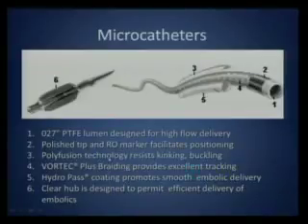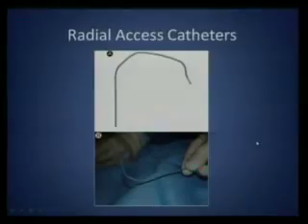It has polyfusion technology to resist kinking and buckling, so the whole catheter has this. These catheters are braided for support and tracking. Hydropass means they have a coating on the inside so that the embolic material goes very smoothly and easily. And they have a hub here through which you can efficiently deliver embolic. So when you use these microcatheters, you have seen me using them. These are the 6 components of a microcatheter.